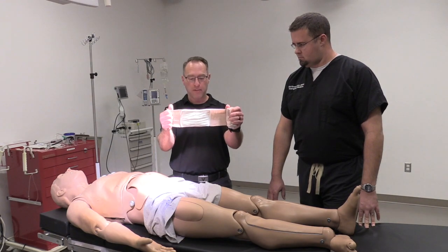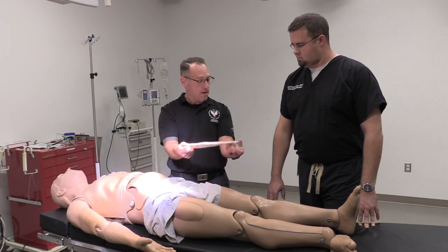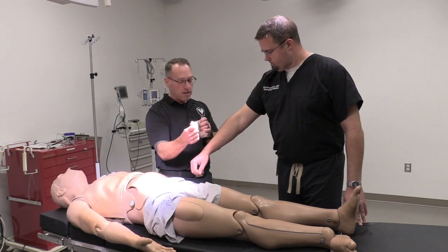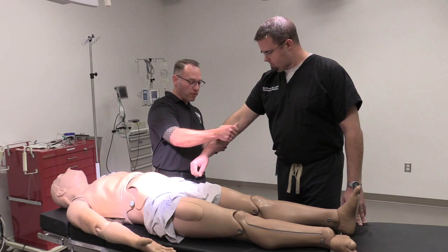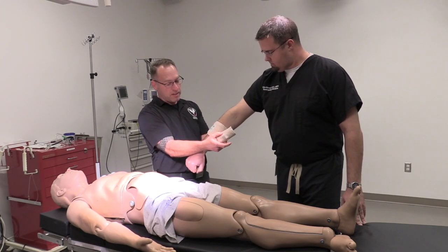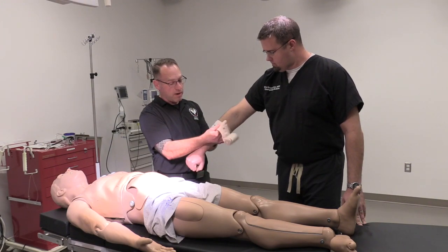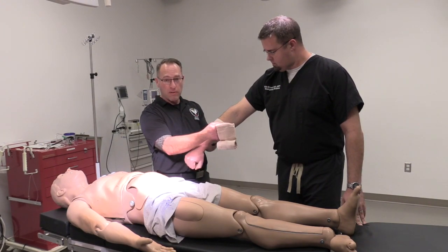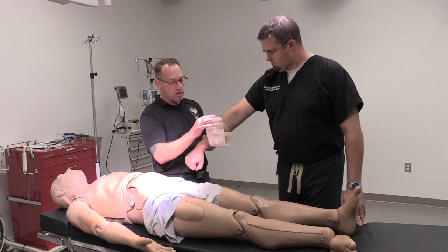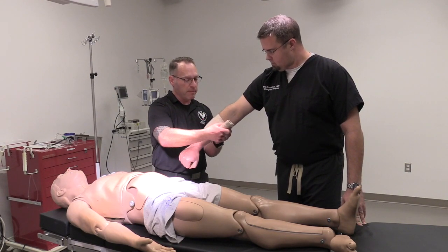All right, basically you've got your dressing and your bandage all as one single unit here. So I don't know if I can borrow your arm here, Doc. So basically what I'm going to do is I'll place the pad over the injury, make my first wrap. And you'll notice that on this particular bandage it has Velcro sewn every so many inches, and what those are are brakes. So if you accidentally let go of it, it's not going to completely unroll on you across the ground, so it helps you to control it. And then as you're wrapping, it helps to grab the bandage and maintain some pressure.